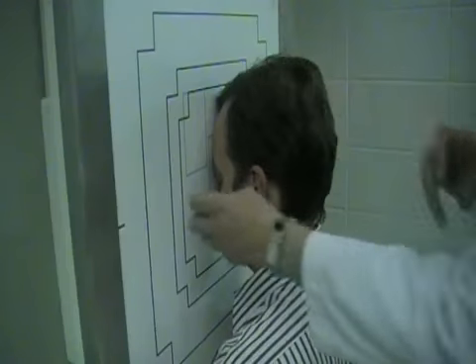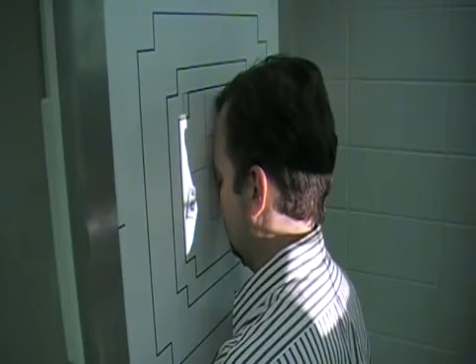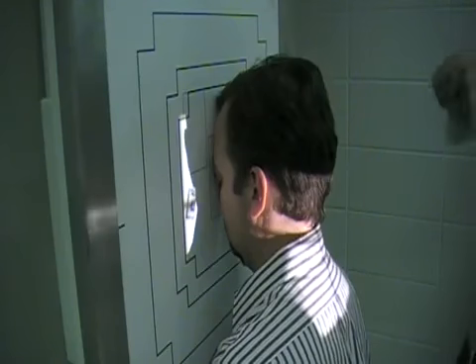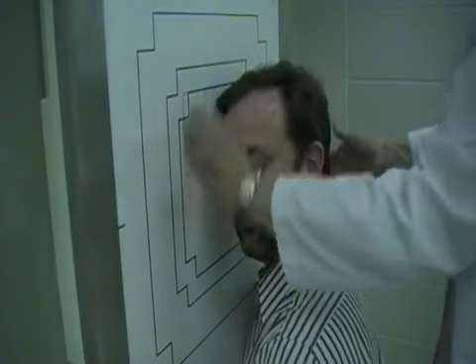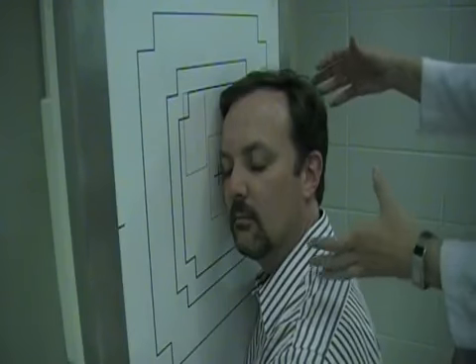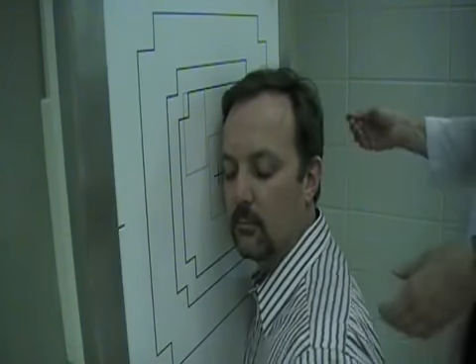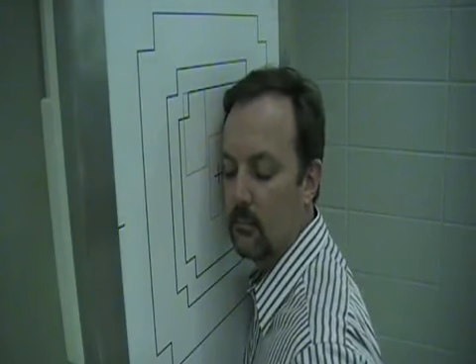Okay, and then put your left marker up here, because that is the left side of the mandible that we're going for. Okay, then on our next projection, we're going to do the axiolateral oblique. And I'm going to ask David to turn his head to the right. You want to do both sides, the right and the left side. Get the head in a lateral position as if you are doing a skull x-ray.